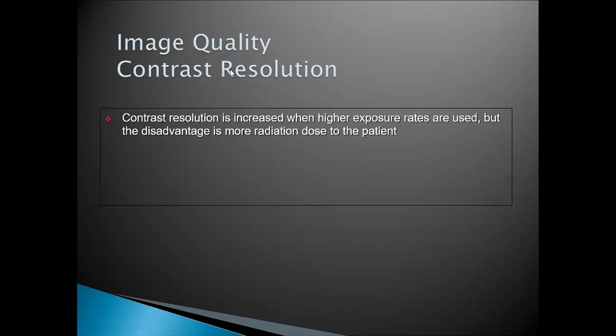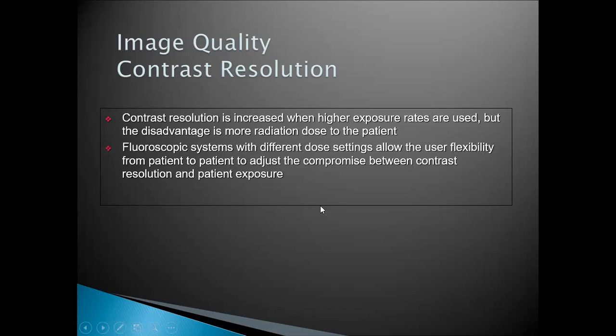Of course, you can increase contrast resolution by increasing the exposure rate, but this is at a price, and the price is more radiation dose to the patient and even to the radiologist by way of scatter radiation. The more dose to the patient, the more they scatter, the more the dose that will come to the fluoroscopists, the radiologists, the urologists, and so on and so forth.